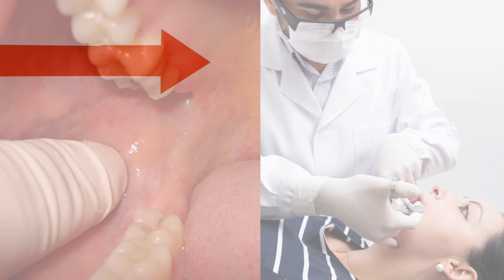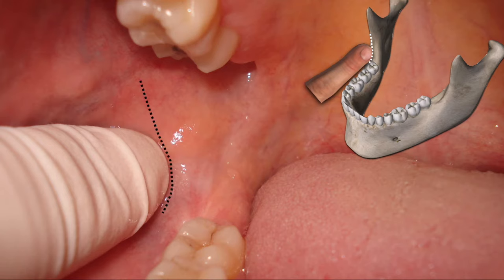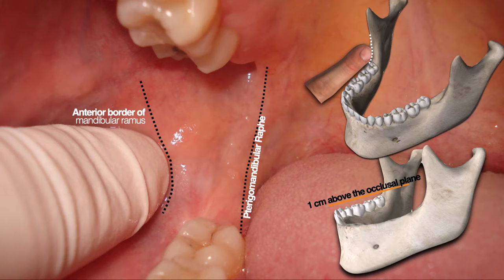Pay attention and understand it definitely. The first step: you should palpate and identify the anterior border of the mandibular ramus. The patient must keep the maximum mouth opening. Your index finger should be parallel, about one centimeter above the occlusal plane. The second anatomical structure that you should identify is the pterygomandibular raphe.